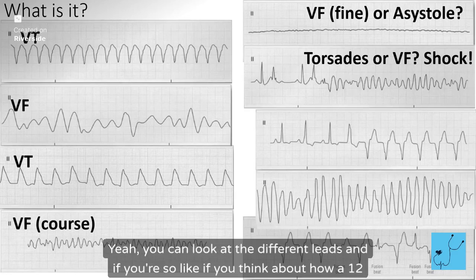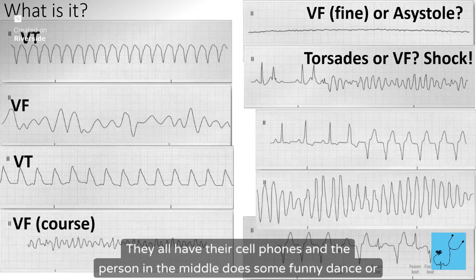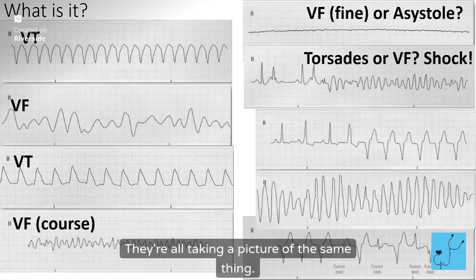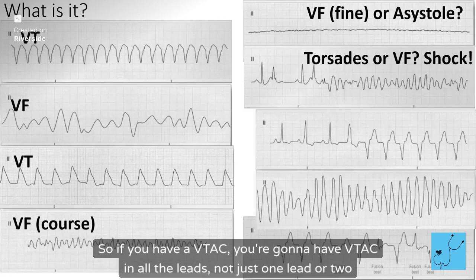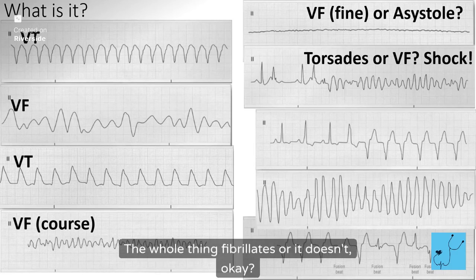If you think about how a 12 lead is done, it's like there's a person standing in the middle of a circle of people. They all have their cell phones, and the person in the middle does some funny dance. Everybody takes a picture. They're all taking a picture of the same thing, but they're all getting something different. So when you look at different leads, you're all looking at the same thing. If you have a PVC in one lead, you have a PVC in another lead. If you have a VTAC, you're going to have VTAC in all the leads, not just one or two, because the heart doesn't just fibrillate in one little spot. The whole thing fibrillates or it doesn't.